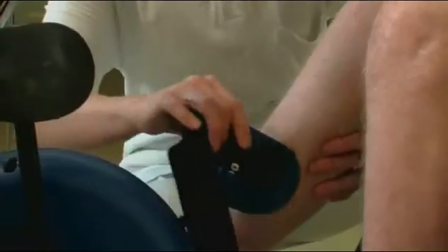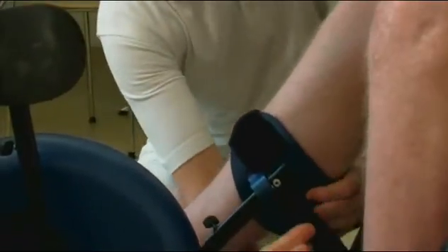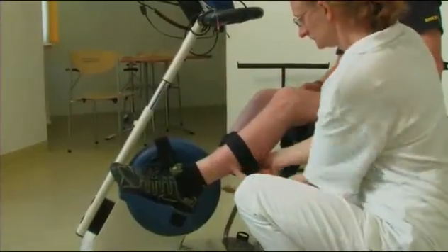Using electrical stimulation in this way can prevent or retard disuse muscle atrophy and relax muscle spasms. Furthermore, it benefits local blood circulation and limb range of motion.